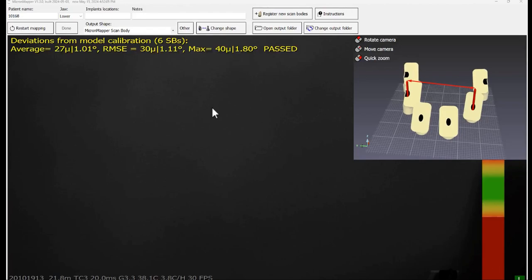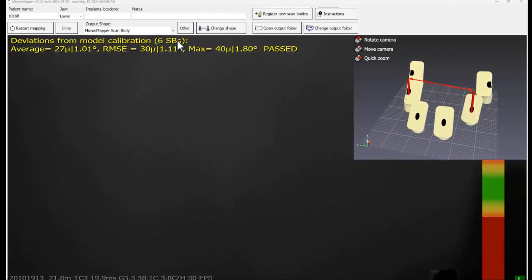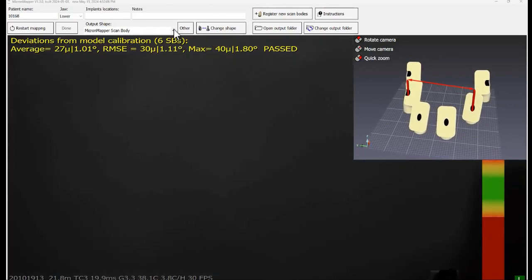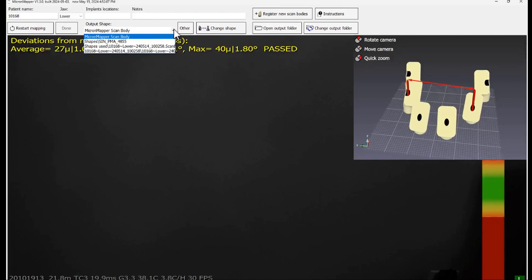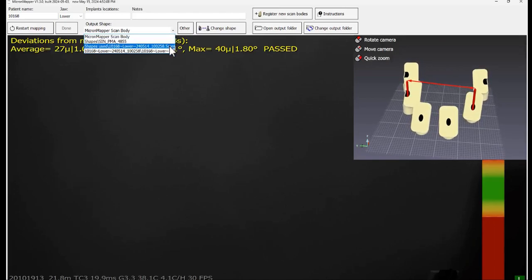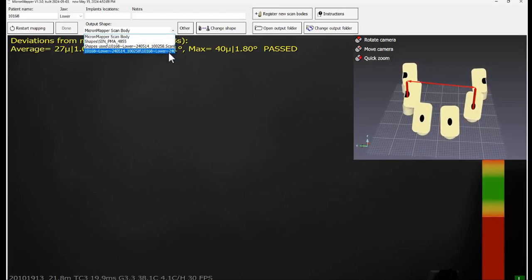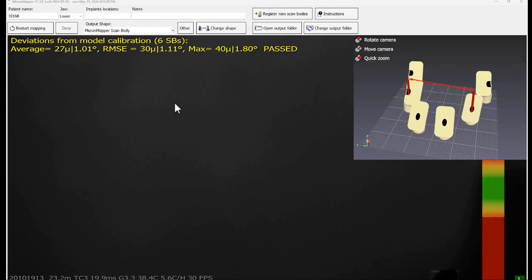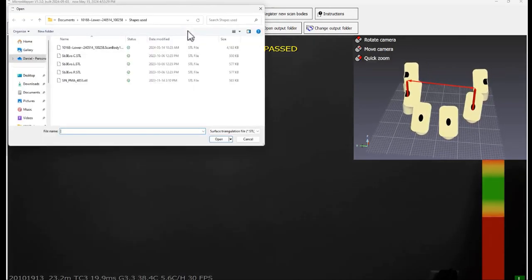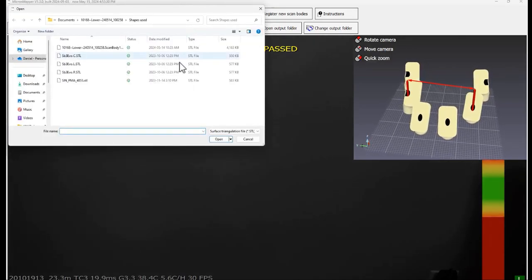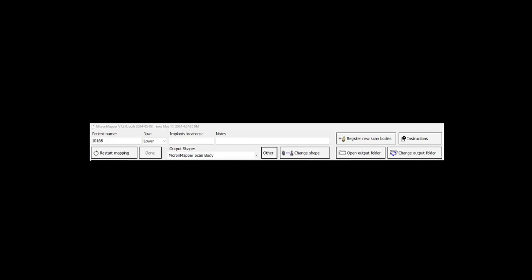Changing the scan body's shape. To change the shape of the scan bodies in the 3D view, you can either select it from the output shape drop down menu, which are the saved shapes, or select some other STLs by clicking on other button. Change shape button can be used to modify the shape of the previously scanned jaw or after the application is closed.